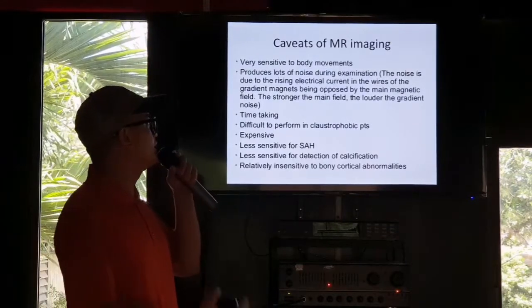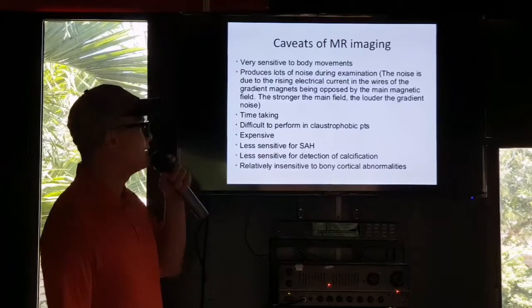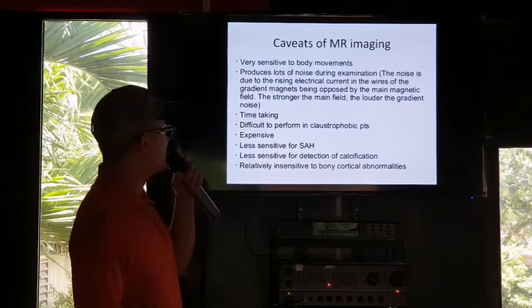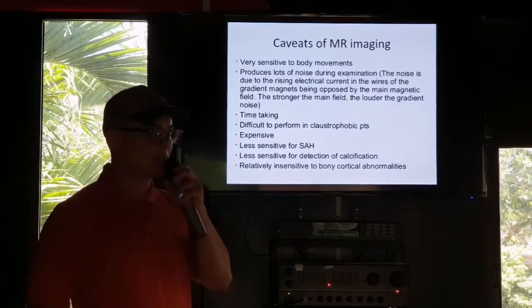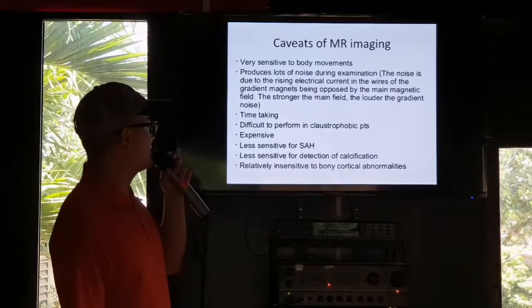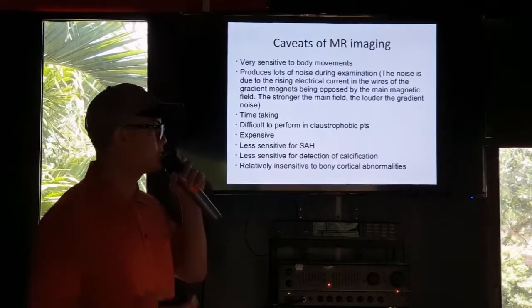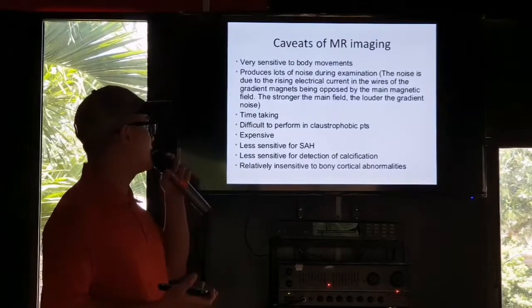It produces a lot of noise during examination, and it takes a long time for MRI to produce images of a patient. And so it's of course difficult to perform in claustrophobic patients.